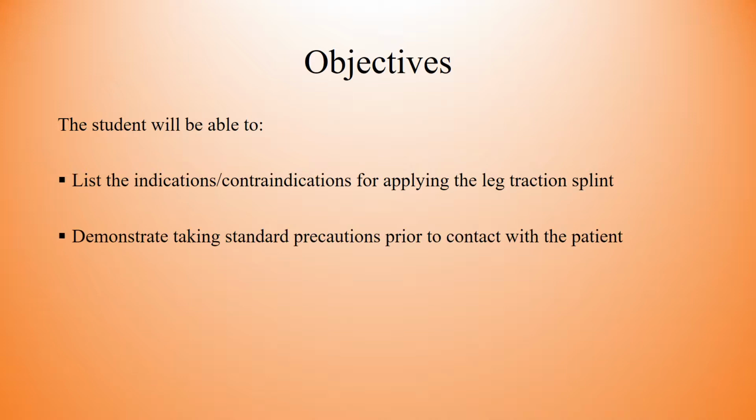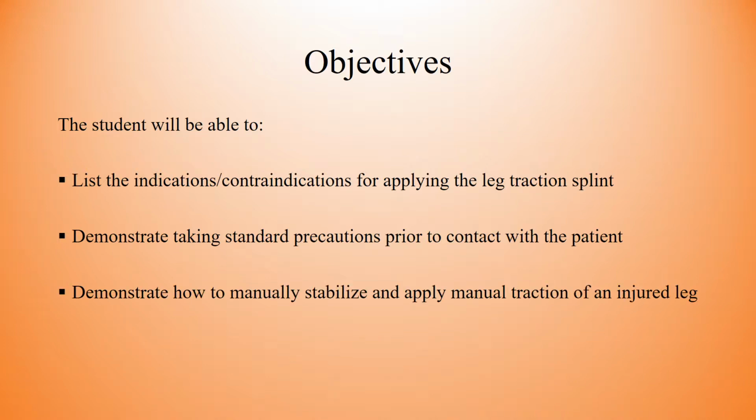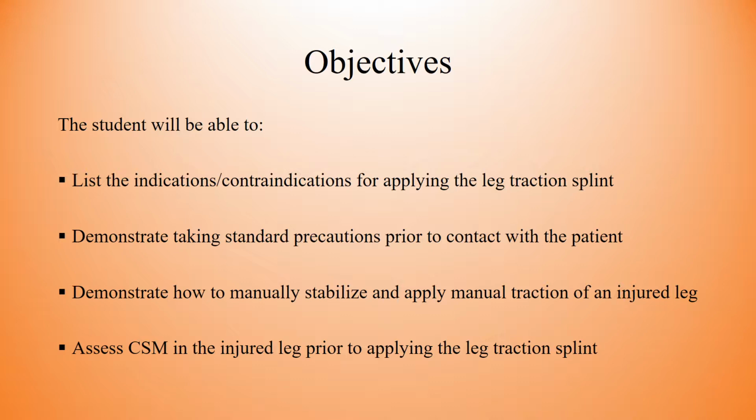Demonstrate taking standard precautions, including a minimum of applying gloves, which we do on all of our calls. Demonstrate how to manually stabilize and apply manual traction of the injured leg. Assess circulatory, sensory, and motor function in the injured leg prior to applying the leg traction splint.